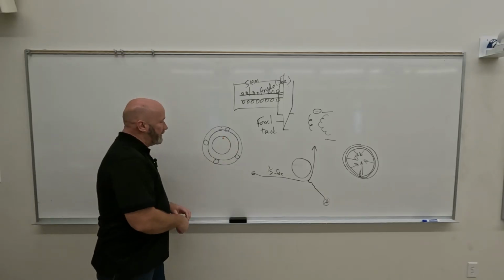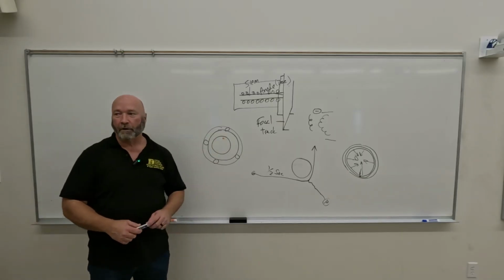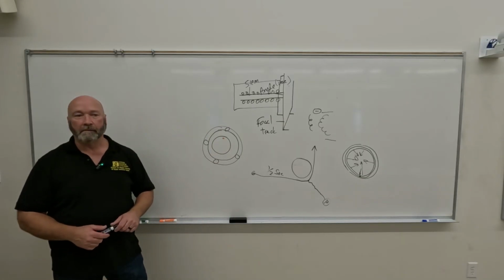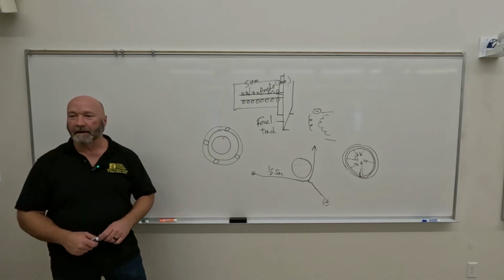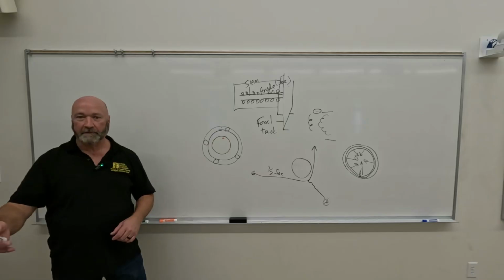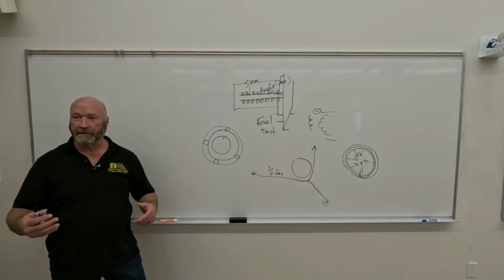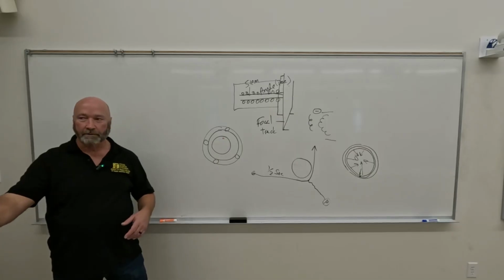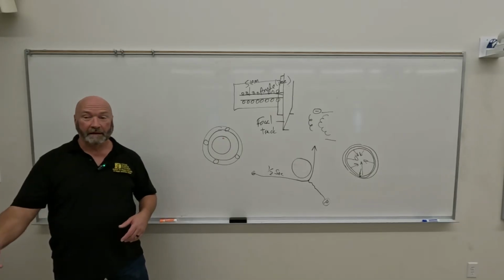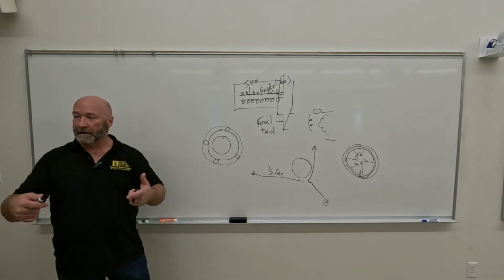And first off, before I start into this, how many x-rays are you creating with your car? Exactly none, right? But yet you can still wear out your wheel bearings. Why? Friction. It's just friction. It's friction driving down the road. Your tires on the road creating a lot of heat. It's also the friction of those bearings rolling around in there, creating a lot of heat.